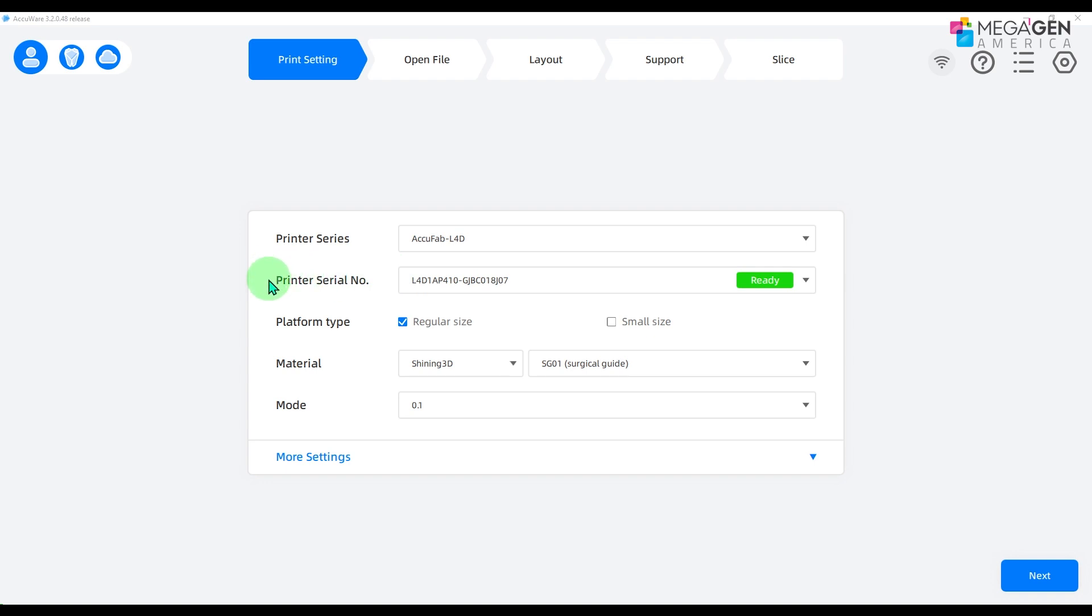Open the AccuWear software. In print setting, the printer type, serial number, and platform type can be seen.